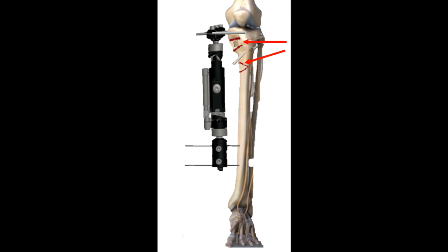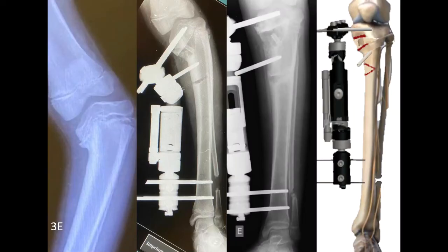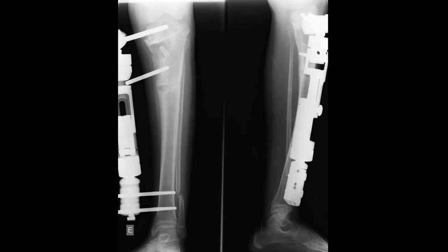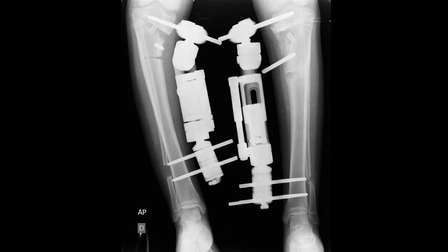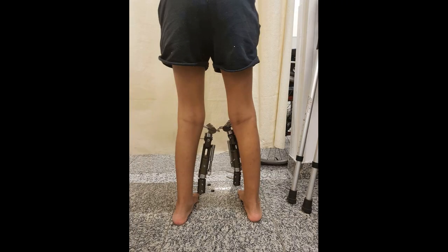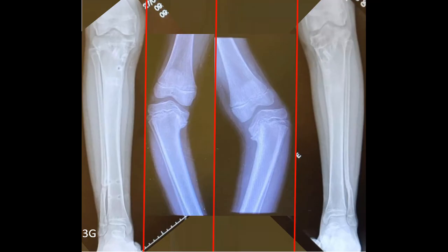When we observe clinically and radiologically that the lower limb is aligned, we stop the distraction and wait for bone consolidation. Here we can observe the sequential and gradual correction of the severe deformity of neglected Blount disease. After observing the correction of the left knee, the patient underwent the same treatment on the contralateral side. We then observe the result obtained after both sides were gradually corrected by the double osteotomy, pre- and postoperatively, with both sides already operated non-simultaneously.